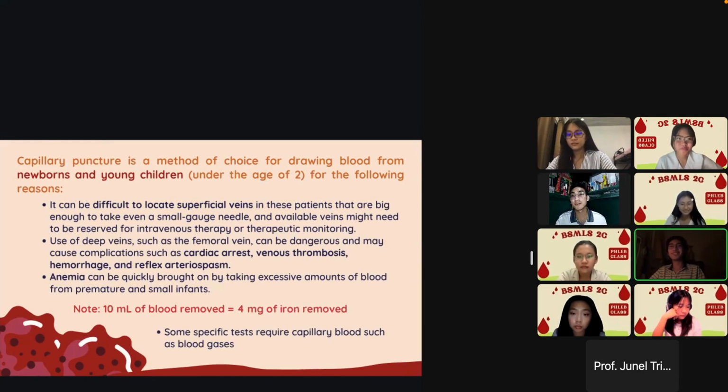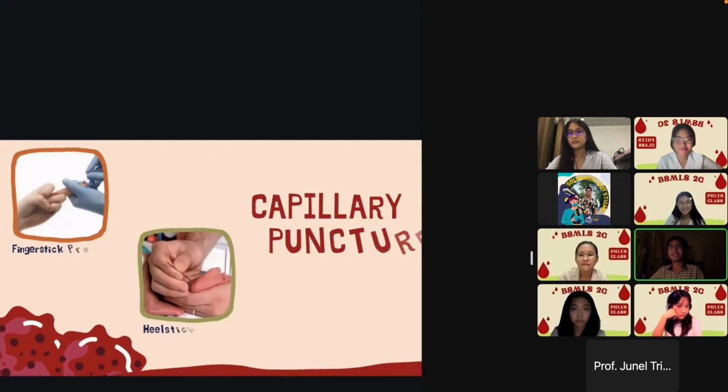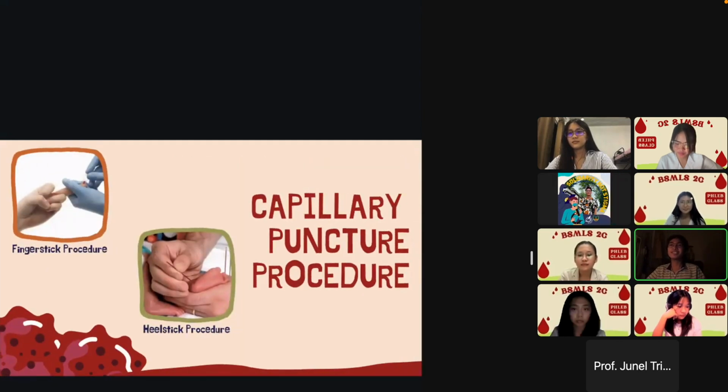So hello everyone. I am Professor Marius. Can you please go back one slide? So we will now discuss the capillary puncture procedure. There are two main ways of administering capillary puncture. First is through a finger stick procedure, and second is through a heel stick procedure.